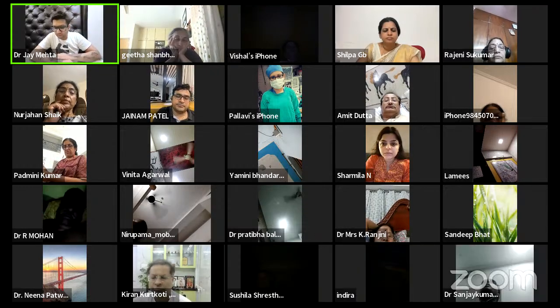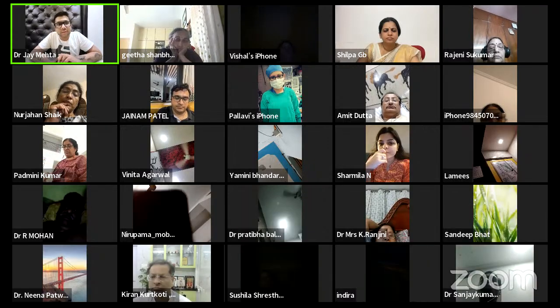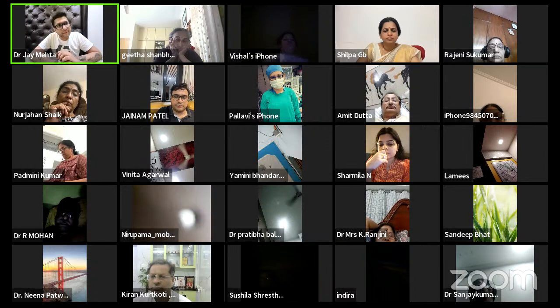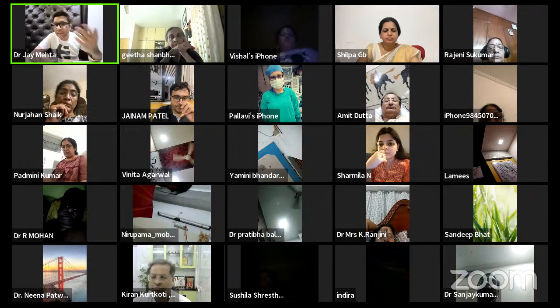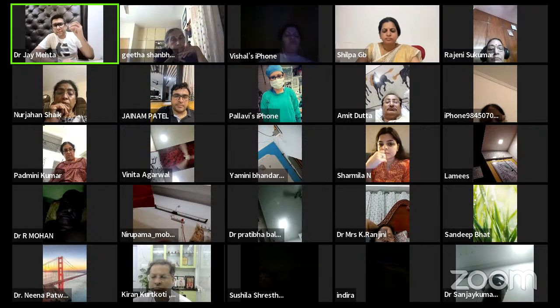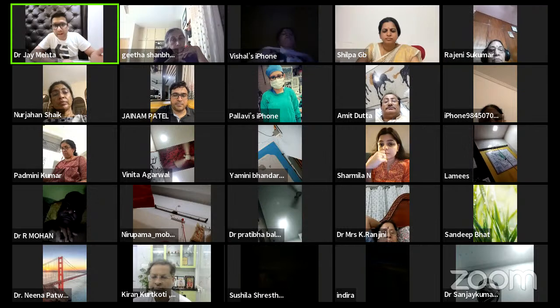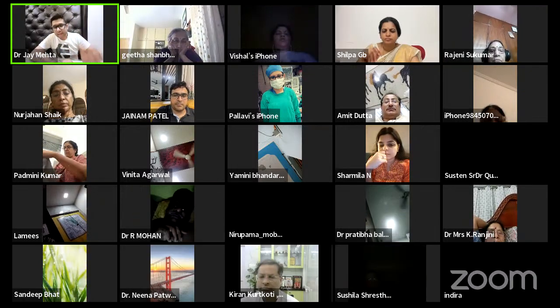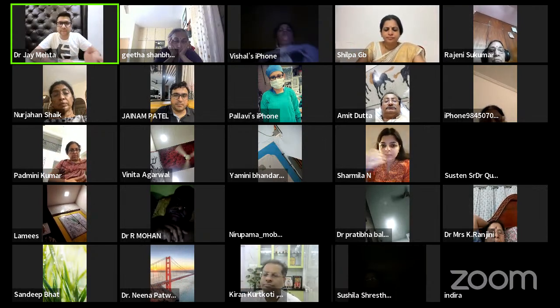Now the question which people will ask is, you are saying to try and avoid, but what if there is a patient who has come from abroad and there is a small polyp which you have seen, and that polyp has to be removed? What will you do in that situation? I have myself posted many of these videos where I have removed these polyps in the same cycle and an embryo transfer has happened. People do become pregnant. I don't deny that. But if you have the liberty of time which is available, then kindly do it one cycle prior. That is something which is important, unless there is an emergency situation.